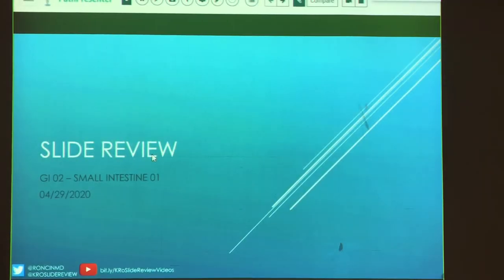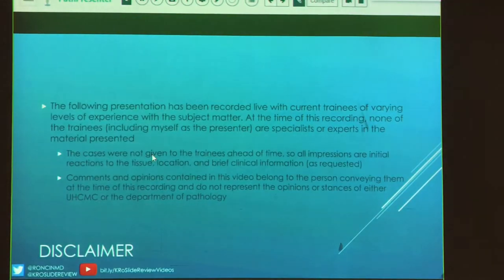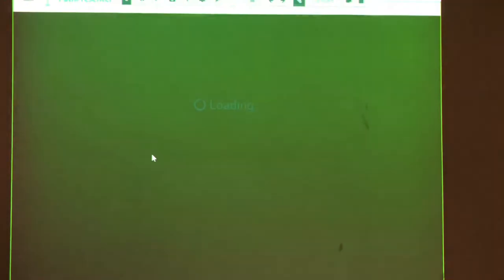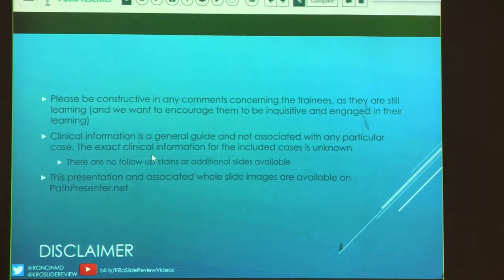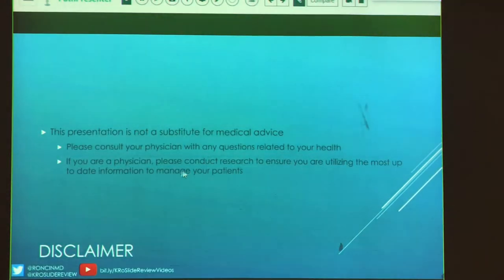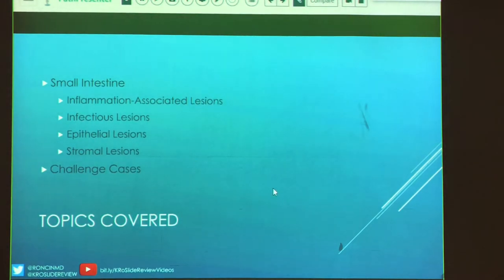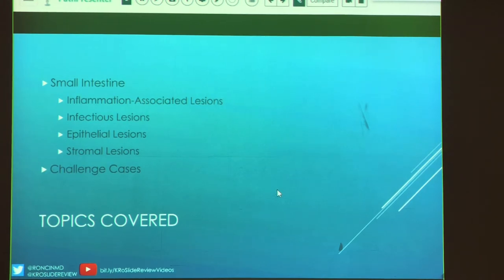This week we have GI2 looking at small intestine. As we do every week, we have our little disclaimer. If you have questions about it, you can ask me in a comment or DM me on Twitter. Today we're going to talk about multiple things with the small intestine. Some of these are a little bit of misnomers, but I've tried to put them into categories to make it easier when looking at different lesions to think of differentials.